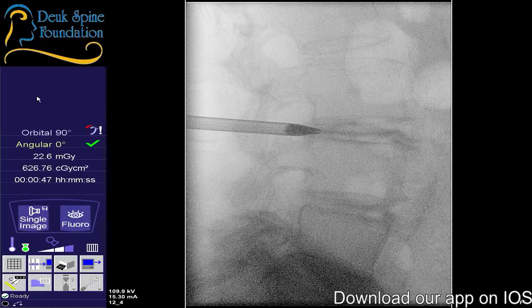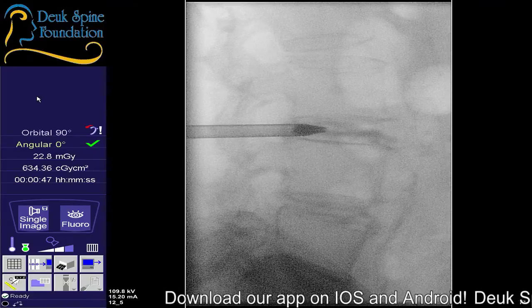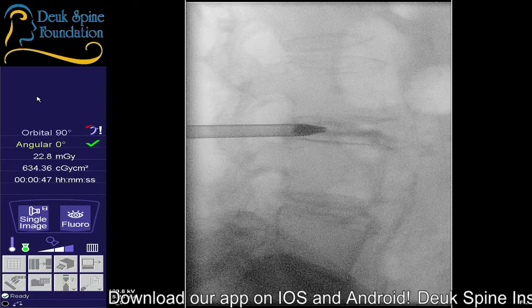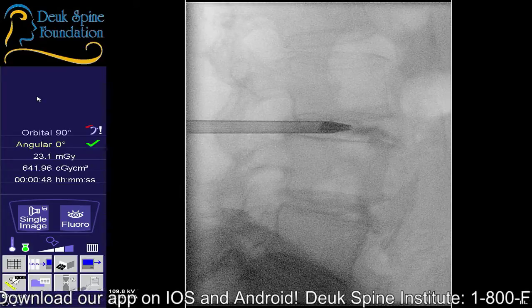Here we go down the tear. Shot. Yep, good. Shot. Yes, all right. So we're into the disc.